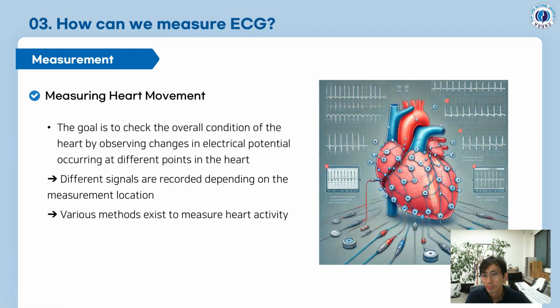Yes. Then we want to measure the heart movement. Actually, if it is possible, we want to put lots of electrodes on our hearts directly, then we can measure our heart movement very, very precisely. But it is difficult and almost impossible. So instead, we are going to record the heart's movement from the outside of our body.